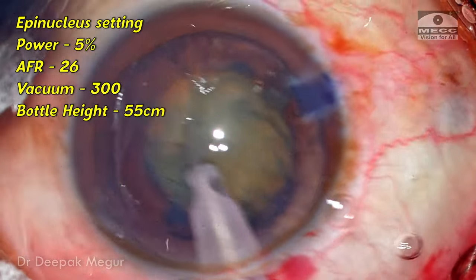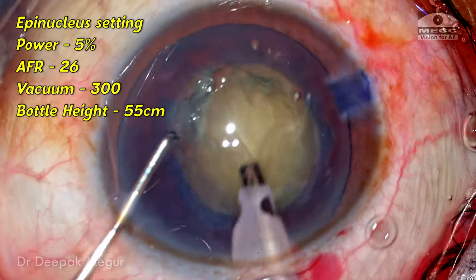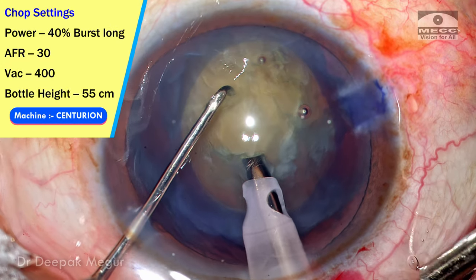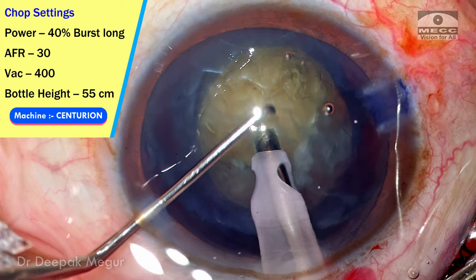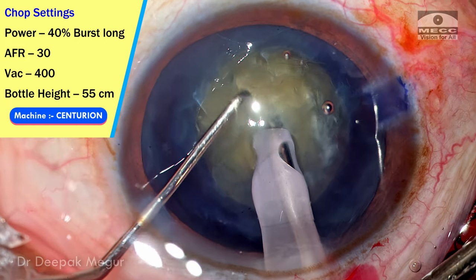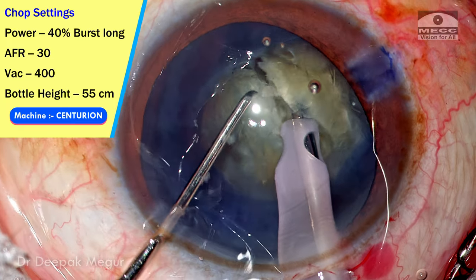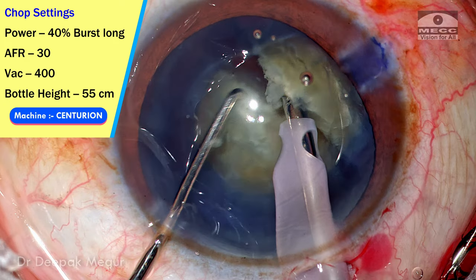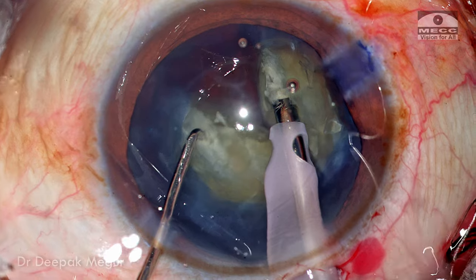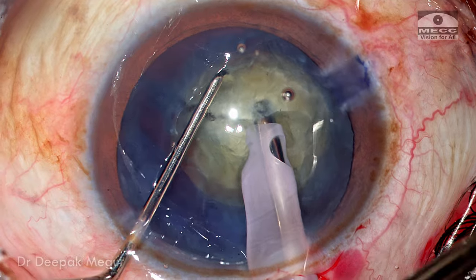I'm entering in epinucleus mode and the bottle height is kept around 55 centimeters. Now switching to chop mode — in all these steps I'm keeping the bottle at 55 centimeters. In chop mode the vacuum is around 400 and the flow rate is 30, which is slightly less than what I typically use. The power mode is longitudinal energy in burst mode. The nucleus is reasonably dense, around grade 3, so it's easy to hold and chop — it's not going to be much of an issue.